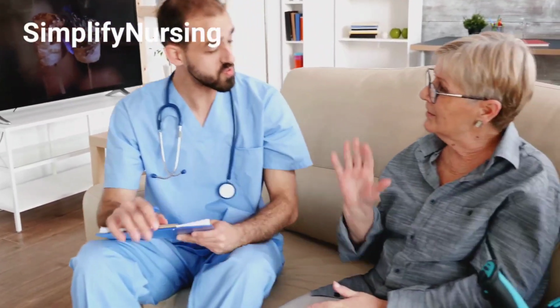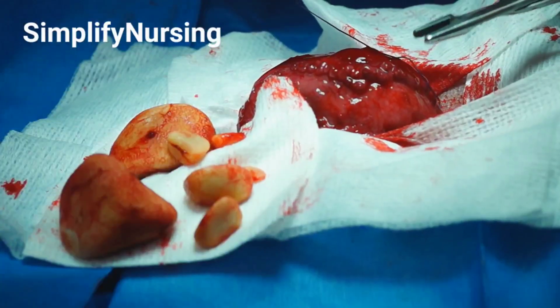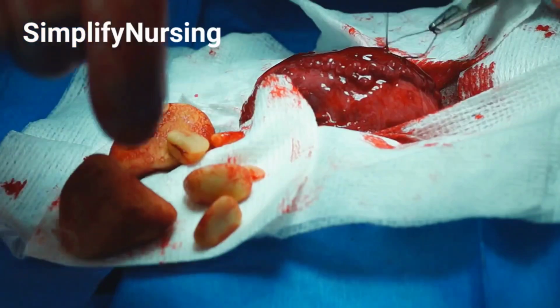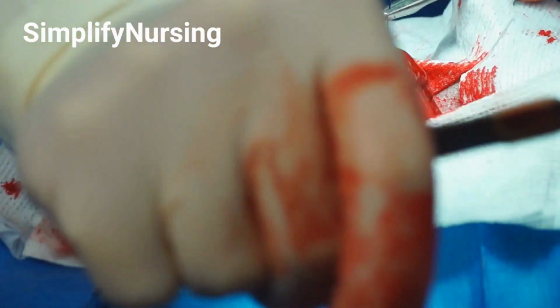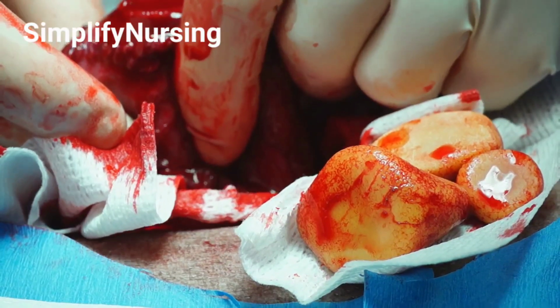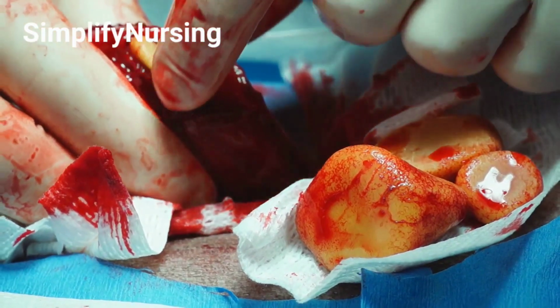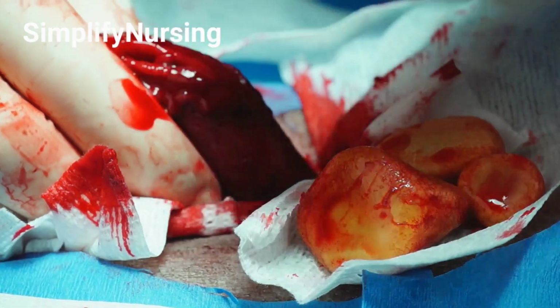So, when is cystoscopy indicated? It's used for diagnosing hematuria, unexplained urinary symptoms like pain or frequency, suspected bladder tumors and bladder stones. On the therapeutic side, it helps with removing bladder stones, taking biopsies, treating urinary obstructions, and even delivering medications like chemotherapy. But it's not for everyone.